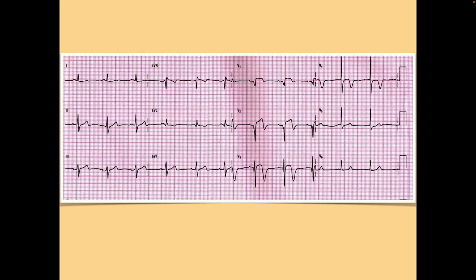Okay, so where do you see ST elevation? Can you summarize it, please? V1, V2, and V3. And what kind of STEMI is this? Septal anterior. Correct. Now remember, first of all, we have 3 contiguous leads. And I do understand that 2 of them are septal, so that's easy. There's only 1 anterior. But the convention is, because it spills into the anterior area, even if it's only 1 lead in the anterior region, we call it septal anterior.